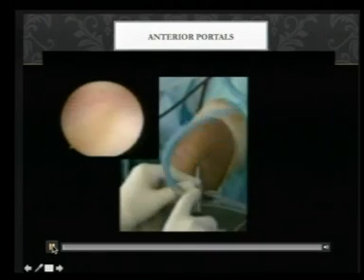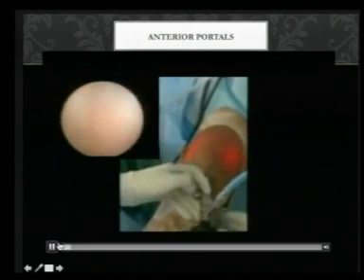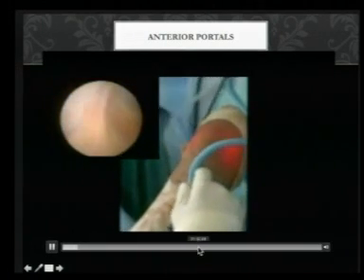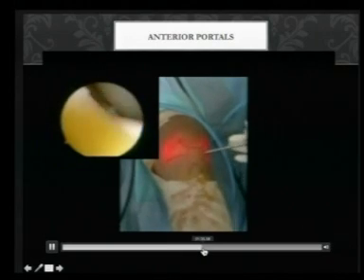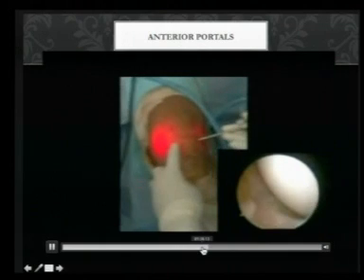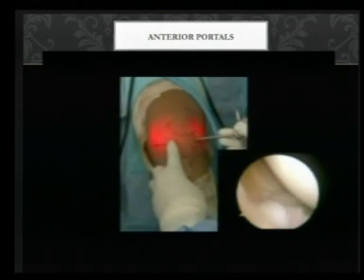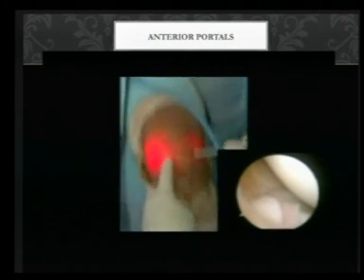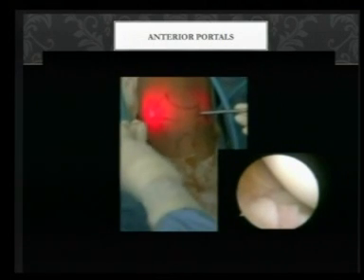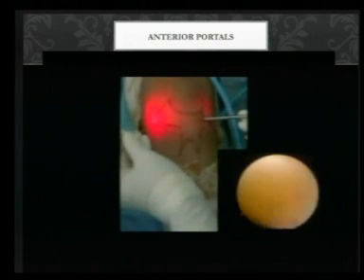In the clipping of usual arthroscopy, left knee, AL portal viewing, once you finish viewing, you make the medial portal. For that, you turn the foreoblique scope towards the skin and make sure you avoid any veins and make the portal where you want to make it. I always use a needle to know exactly where I want to go, whether it is going to be a viewing portal or a far medial portal.